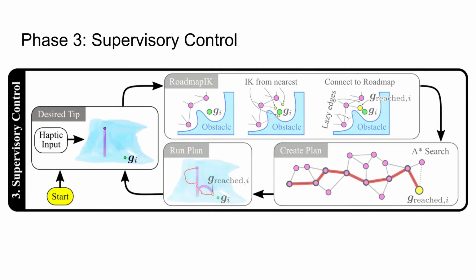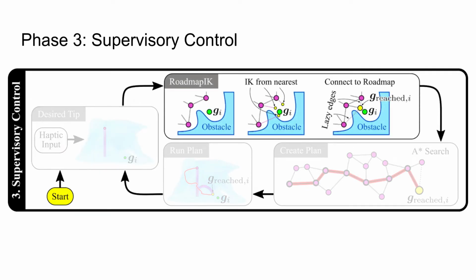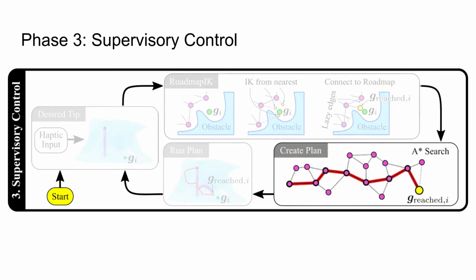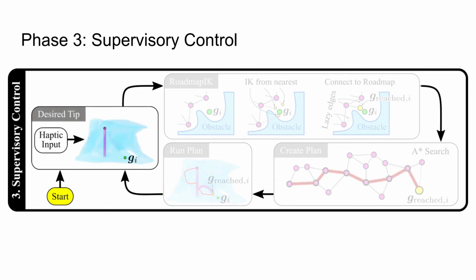The clinician provides a desired robot tip position. We run our roadmap-IK algorithm to generate a goal configuration. We generate a plan over the graph to the new goal configuration, execute that plan on the robot, and wait for the next desired tip position.